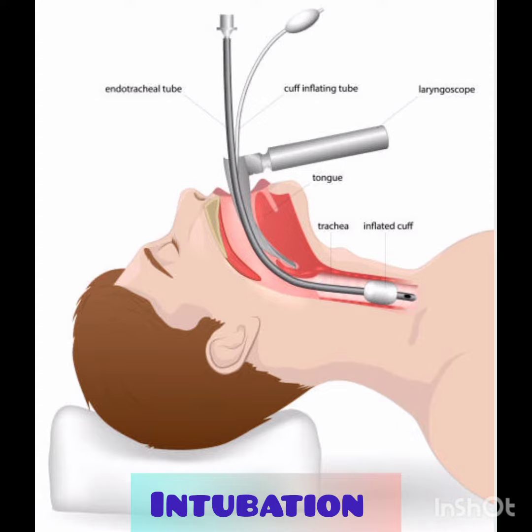So there are many kinds of intubation, but the common ones are nasogastric intubation, endotracheal intubation, and fiber optic intubation, and in neuro patients the most commonly used is tracheostomy. So what is the procedure behind it? The procedure depends on its purpose, whether it occurs in an operating room or an emergency situation.